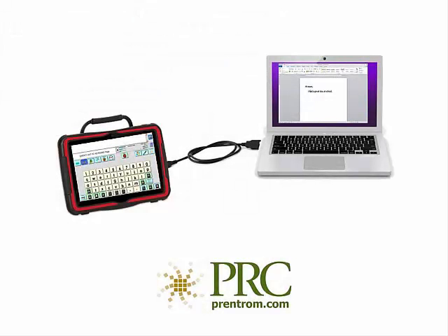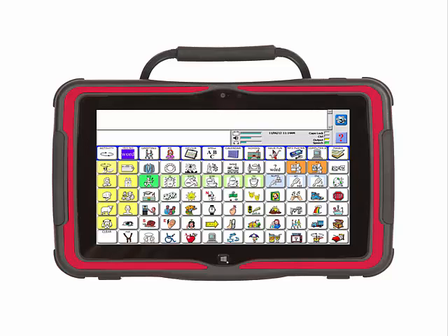In addition to sending keyboard commands, the Accent will also act as a mouse and move the cursor around the computer screen. To do this, locate the mouse page in your communication program. The mouse pages are typically under a key with Computer Access.